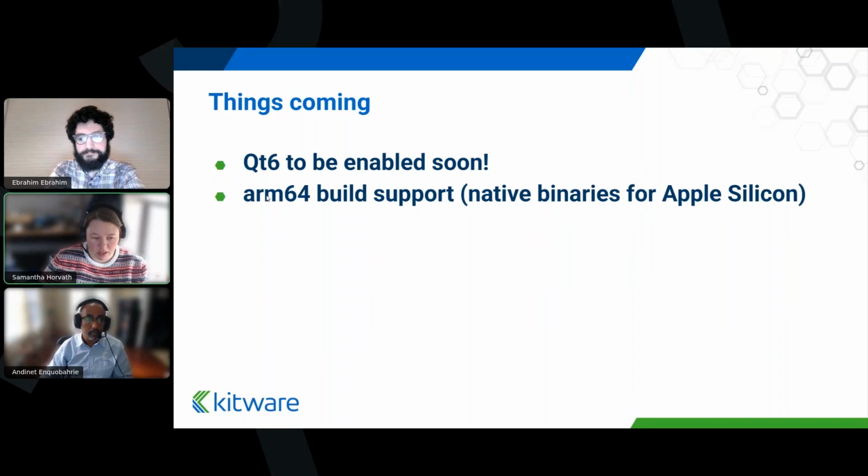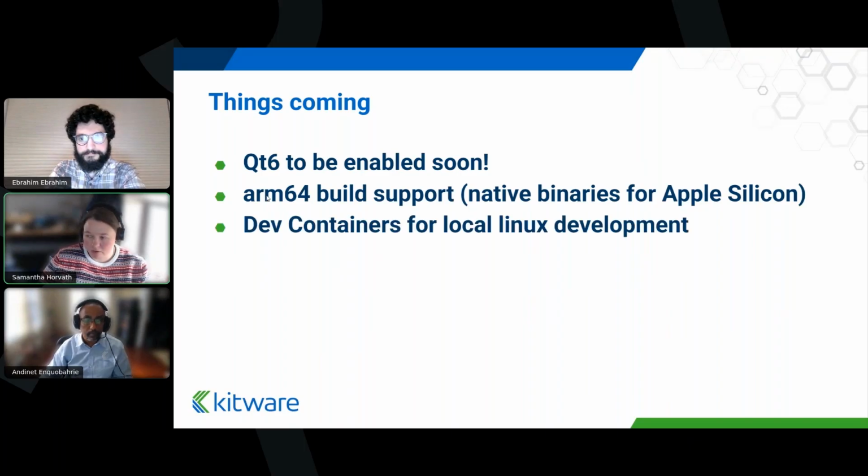We're also looking at improving development environments for our ever-expanding community development team, making it easier to jump into developing with 3D Slicer without having to fully manage and spin up the development environment on your own system.